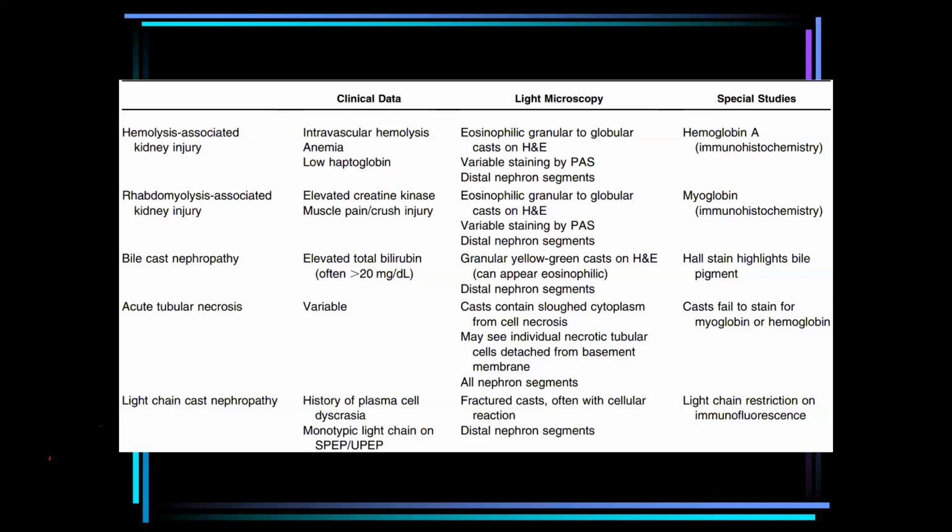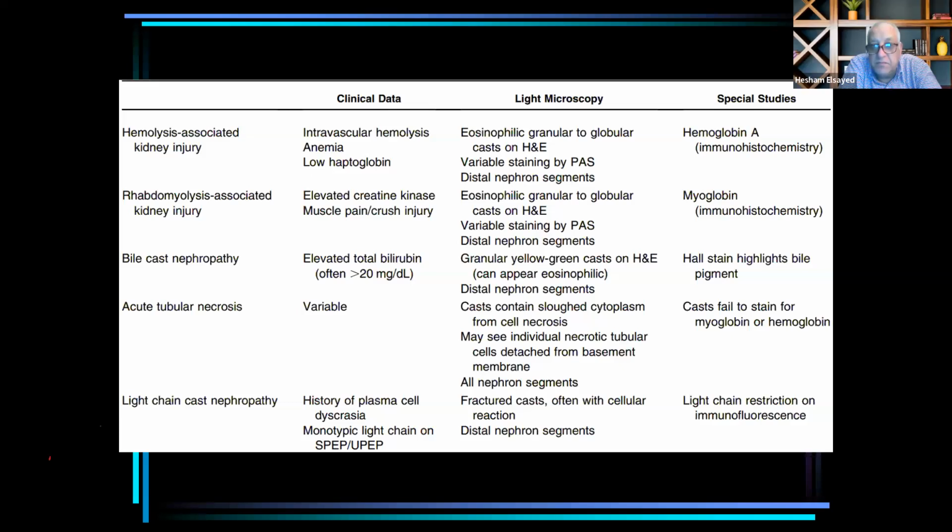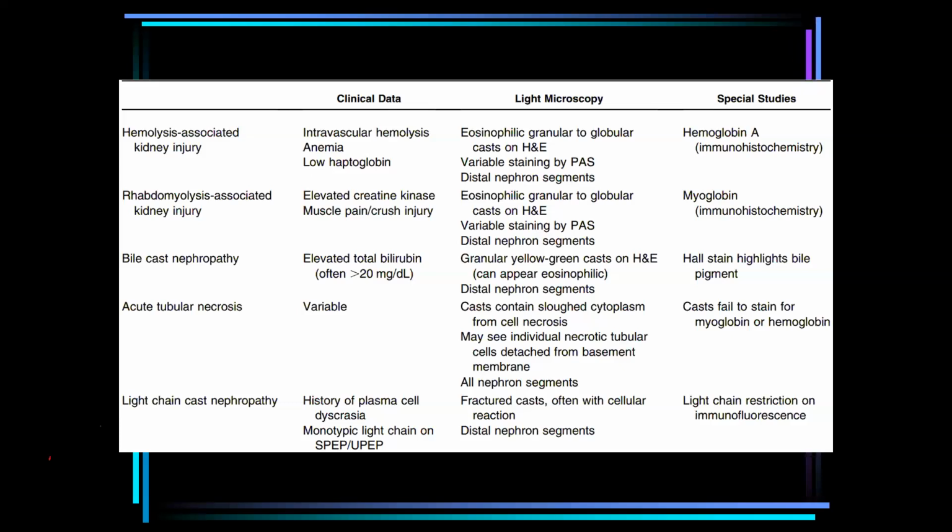Yes, I agree. In the majority of cases in clinical practice, we don't resort to doing a renal biopsy. We diagnose this in the majority of cases in the clinical scenario. And actually, as we see, the patient will be in a complicated scenario that will not help to make a biopsy for him. But in case it is done, this is the way to diagnose and to use this special stain to help diagnose the bile cast nephropathy, if we would like to certify exactly what is behind this acute kidney injury.